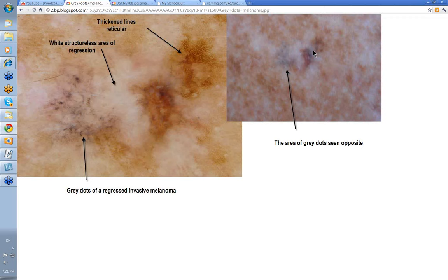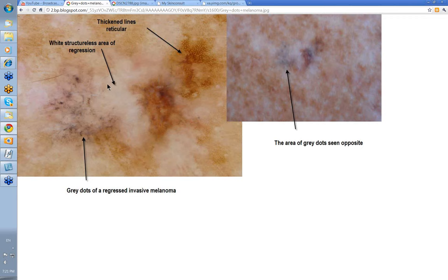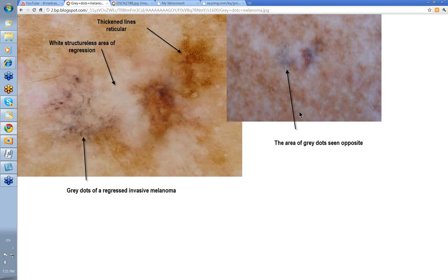Looking at another grey dots case — there's the clinical lesion. You see the grey, you see the darker colored area, and then you look at the dermatoscope. There's thickened reticular lines, a disrupted network, and quite a structureless area which is scarring — you can see the color is much different from the surrounding skin. This is a scar-like, structureless area of regression. Then you have these grey dots: a mixture of finer ones and some quite coarse ones. When this was examined it was a regressed invasive melanoma. Regressed dysplastic nevus, regressed melanoma, LPLK — you can often only give a differential when you see a lot of grey dots like this, but the presence of these structures and the clinical picture is certainly suggestive of a melanoma.